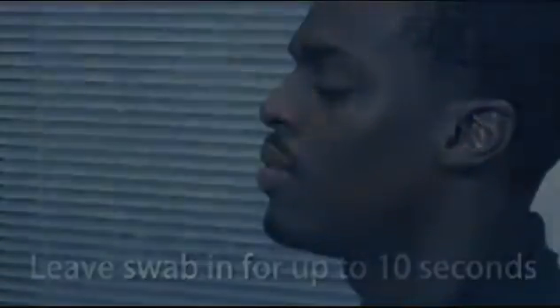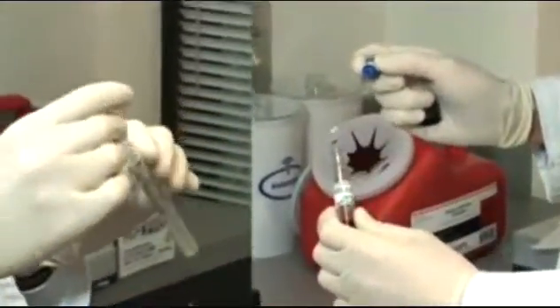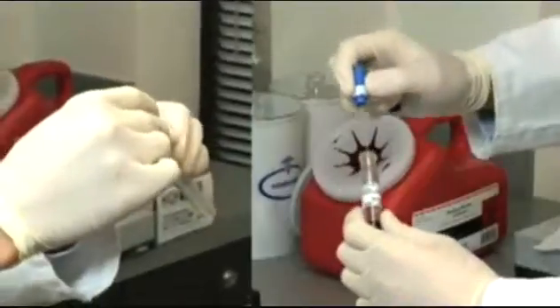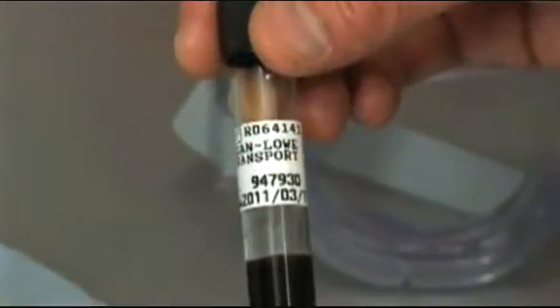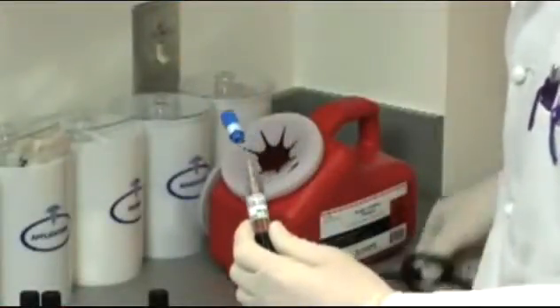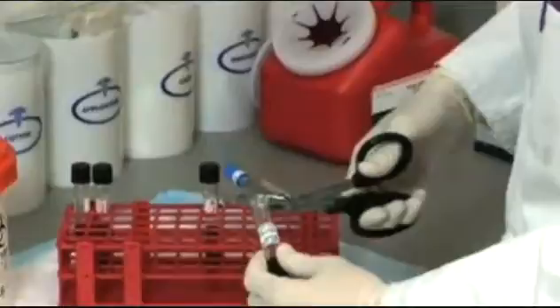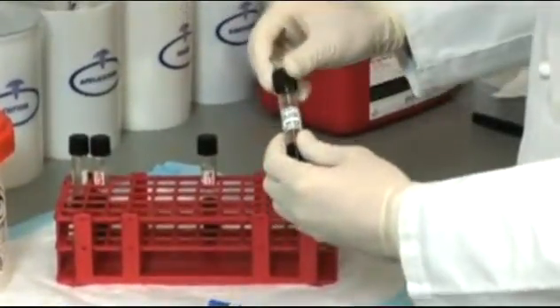After collection, place one NP swab in a Regan-Lowe transport tube for culture, and the other NP swab in an empty tube for PCR. It is important to use Regan-Lowe transport agar, which contains the antibiotic cephalexin, to prevent overgrowth of normal nasopharyngeal flora. Depending on the brand of swab used for collection, the shaft may need to be bent slightly, cut, or broken off at the score mark to fit the swab into the transport tube.